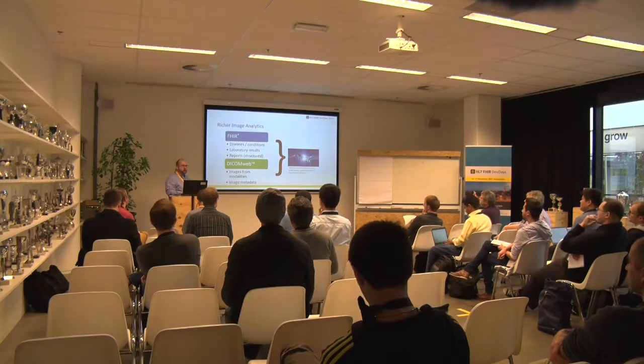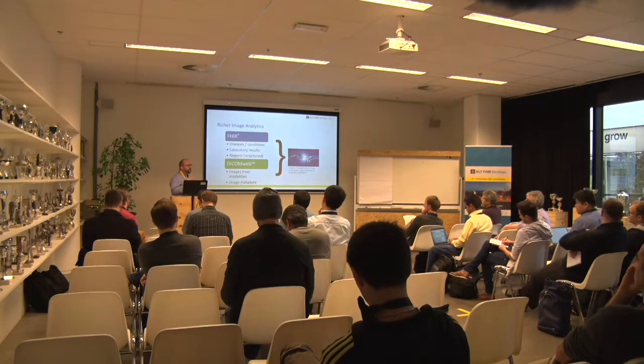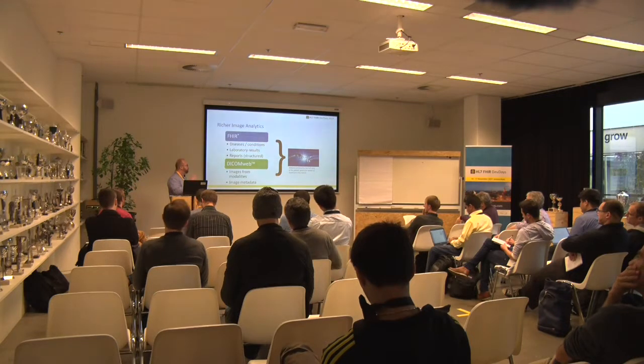If I were to look at analytics, which is really the next generation in the imaging space, it's the current hot topic. Looking at images themselves, we've been doing for a long time, like looking at a CAD, say, oh, we've got this great circle detector for CT studies, looking for what could be lung cancer. Enriching that with FHIR data adds an incredible dimension on actually analyzing these images. And we can do a much more refined job of picking up conditions by combining both the imaging with the data about the patient as well.